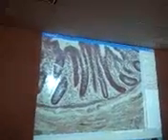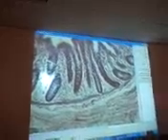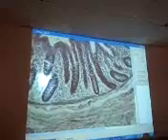Intestinal space. You don't have nearly the same amount of this villus type of structuring. You do have a little bit of it, but then you get down into these guys. These are your intestinal crypts again. So you've got crypts referenced here, just like you had before, just at the base of these little goblet, little villi type structures. Lamina propria is this stuff right in here, basically in the mucosa.